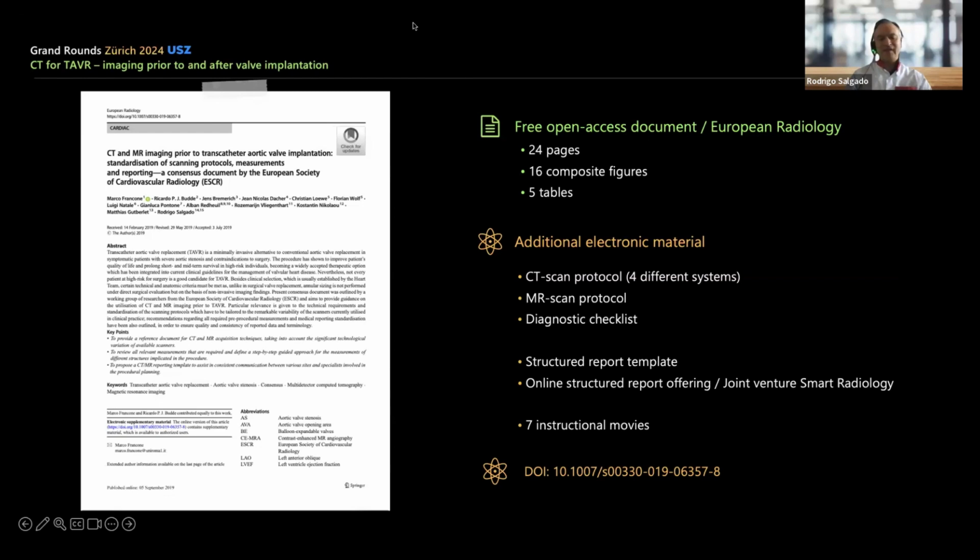When we have extensive calcification at a particular point, we mention that because it's important for the deployment of your transcatheter aortic valve. We work with self-expandable valves, meaning that when you have extensive calcification, you can expect that the valve will not expand at a particular location to its maximum. But you have also to realize that the valve function of a transcatheter valve is just on a supraannular level. It's just above the annulus. So as long as your annular and supraannular expansion is okay, it doesn't matter that much if above that your valve does not expand very much, because your valvular function is at an annular level.